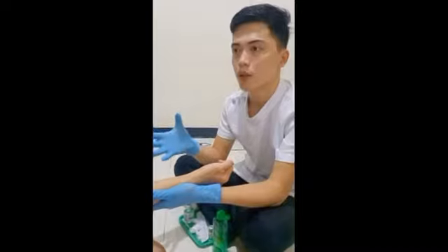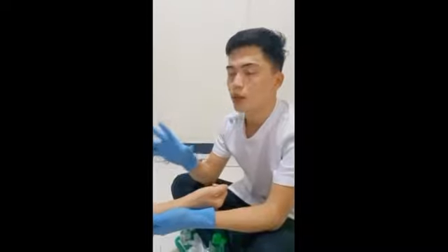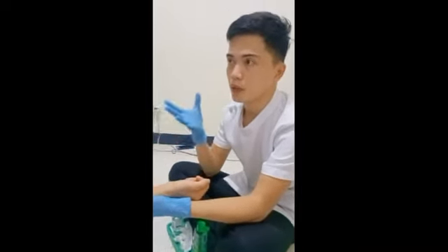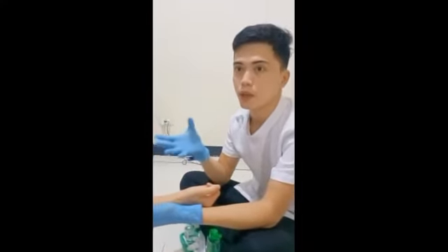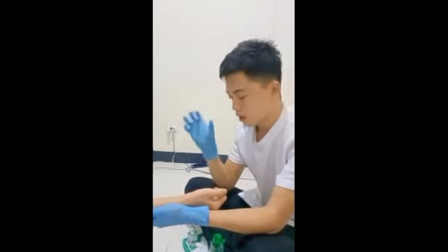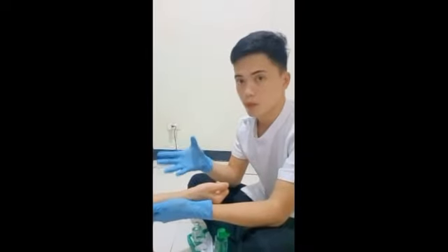So for example, I have an antibacterial. For this procedure, I need to assume that I inject 0.1 cc in the skin test. So if the sterile water is 0.9 and the medication or the antibacterial is 0.1 cc, it is completed for the 1.0 cc.